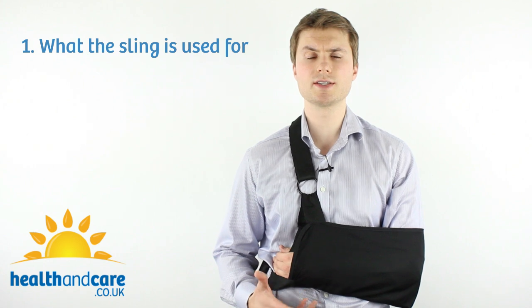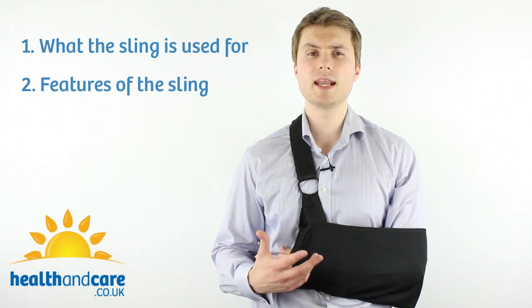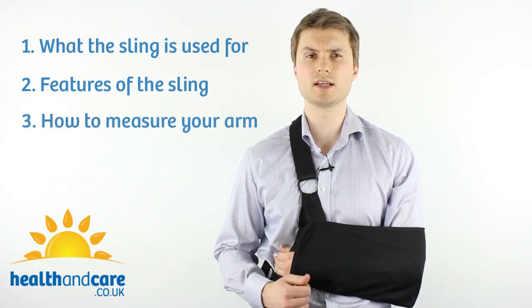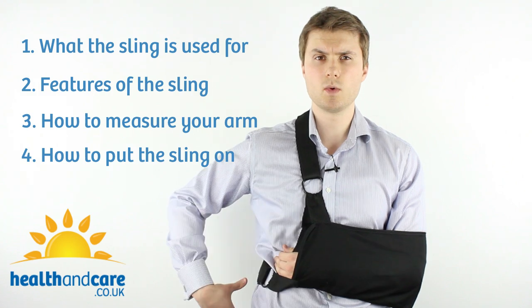First I'm going to talk about what the ProCare Clinical Shoulder Immobiliser is used for. Then I'm going to talk about a few of the features of the sling, including what it's made from and how to wash it. Finally, I'm going to show you how to measure your arm to get the right size sling, and I'll be putting the sling on — showing you from scratch how to put the ProCare Clinical Shoulder Immobiliser on your arm and around your waist.